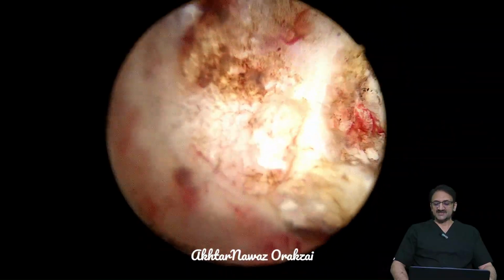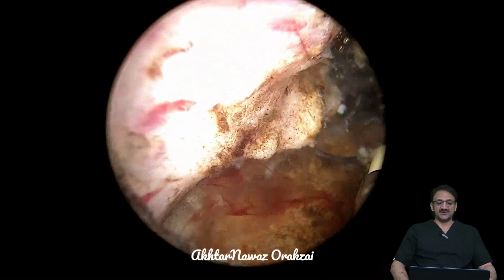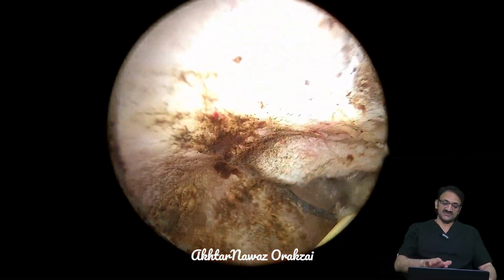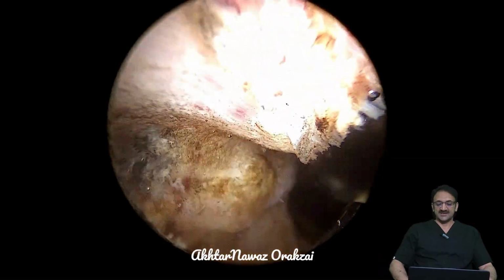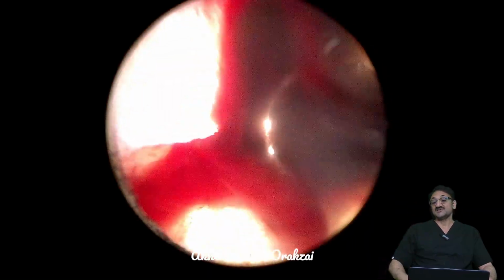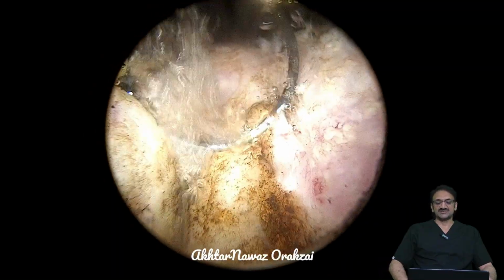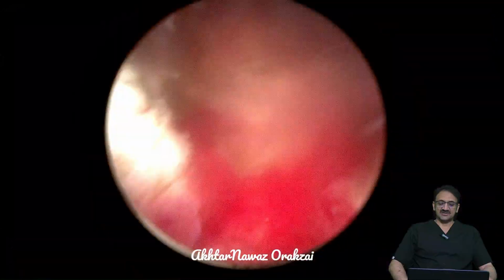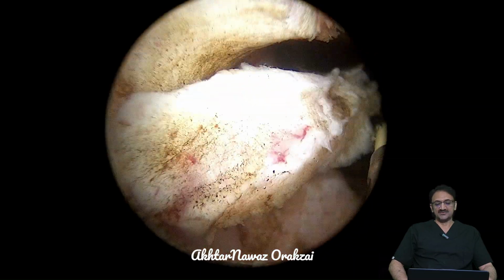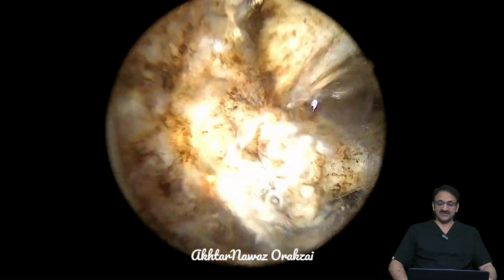So the median lobe is resected, as is always my preferred method. I resect the median lobe half, and then I start resecting the right lateral lobe from 7 o'clock to 11 o'clock, and then I resect the left lobe from 5 o'clock to 1 o'clock, and then I see if the anterior lobe needs resection or not. But in 90% of the cases, I do not resect the anterior lobe because it is not contributing to the obstruction. That is my way of doing things, and I always try to preserve the bladder neck, whether the patient is sexually active or not.